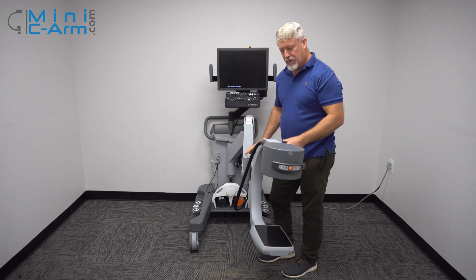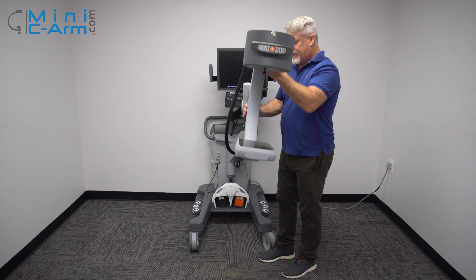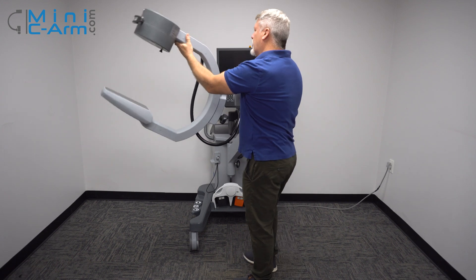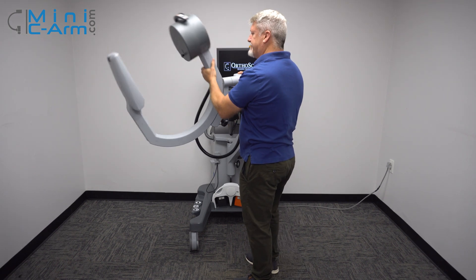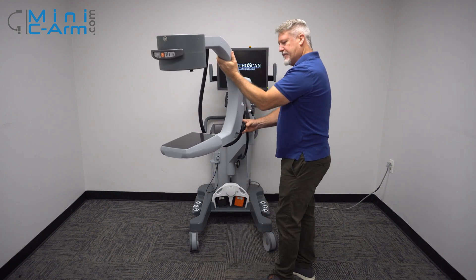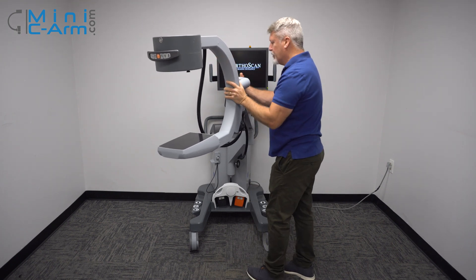This is about how low it goes and the height. And here's our orbital rotation. And the wigwag too.